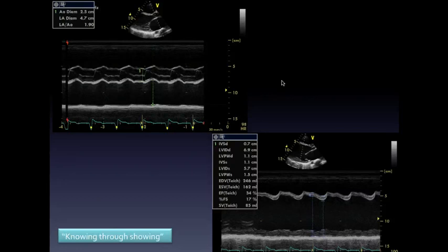This left atrium is big, and this left ventricle is big. But hang on, we got 5.7 centimeters. Didn't I think it was 7? Okay. So the point is, no single technique is going to give you absolutely consistent results. So the point is, I don't really mind whether it's 6.1 or 6.2. It actually came out at 6.9 on this, right? But it's only a freak that it's anywhere within a few millimeters. And I'll be honest about it, you'll keep measuring until you get the same answers. Human nature is to round it out. But this is a big heart.